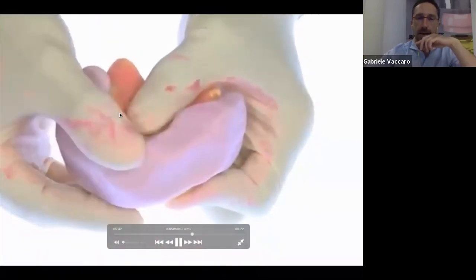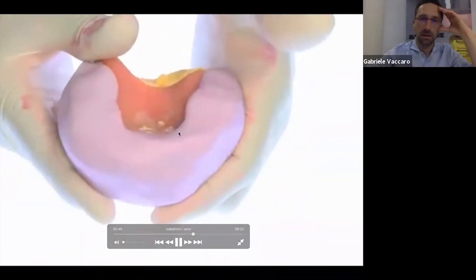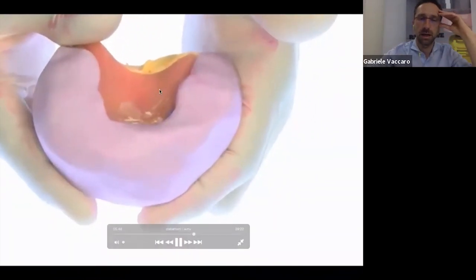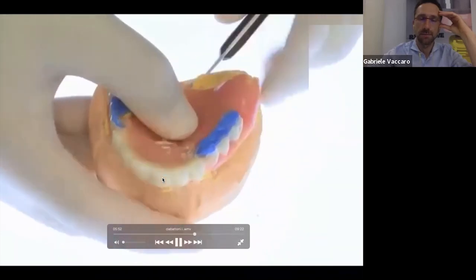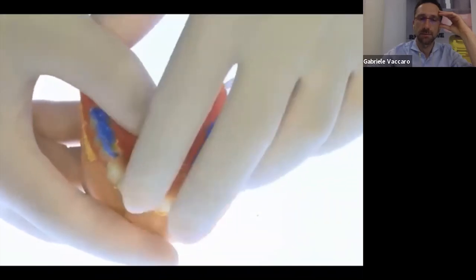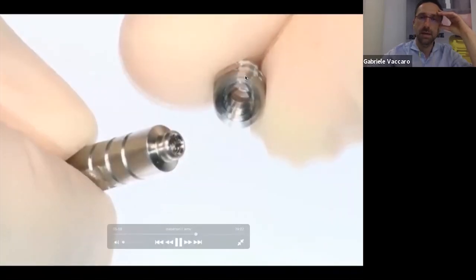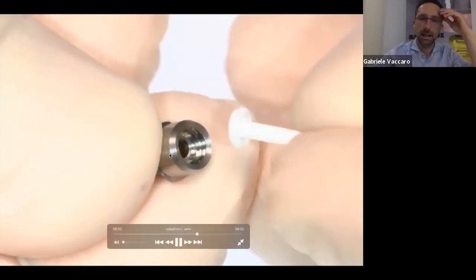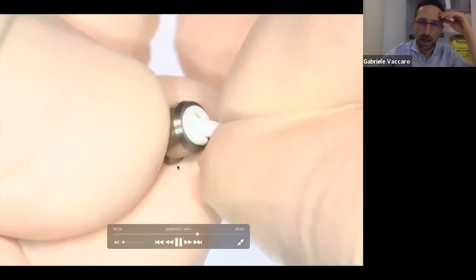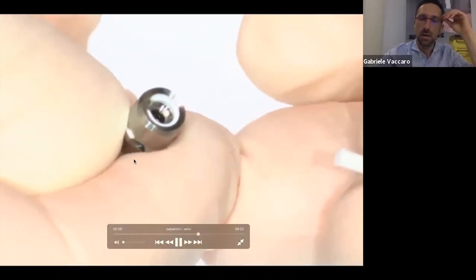After that, the stone is made out of this impression. Perfect. And then we use this kind of abutment. You see that there is a track here, a hole and a track, where you can pass through a wire.